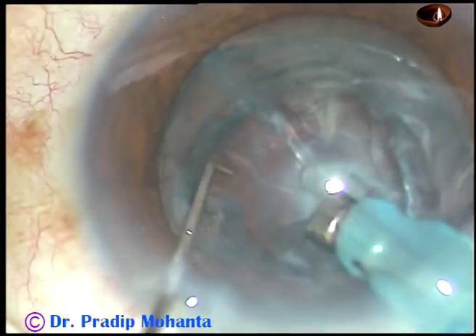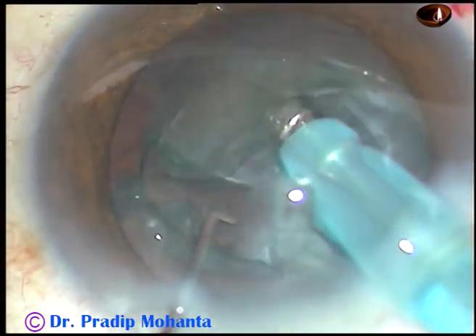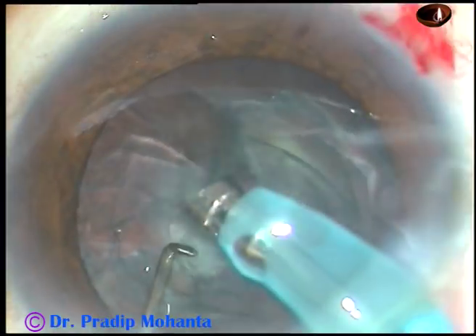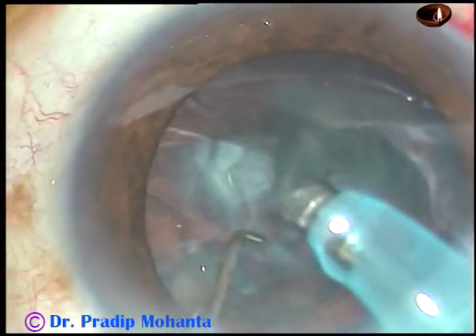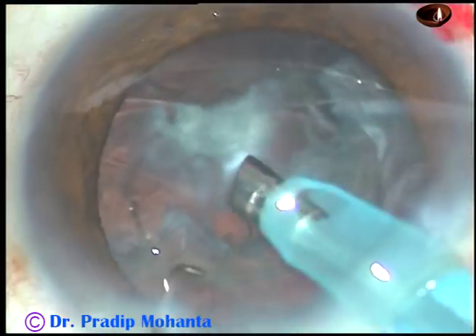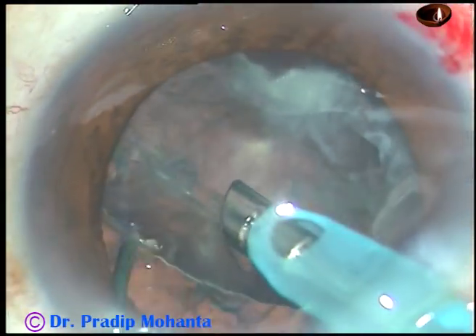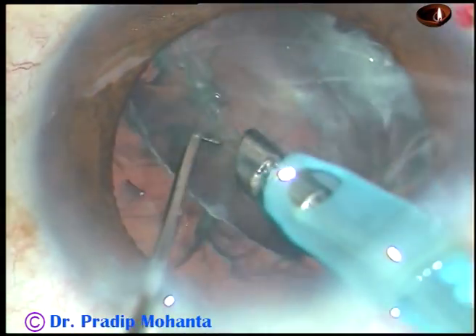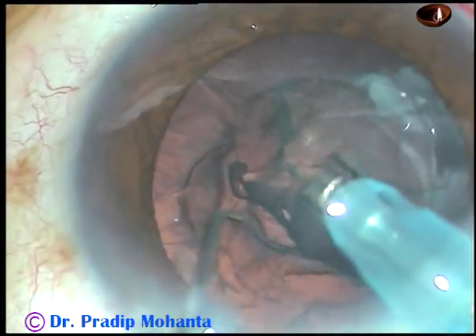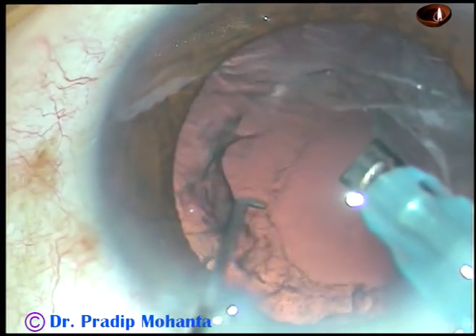The nucleus has been very nicely managed over the epinuclear shell. Even if a complication occurs now, no nuclear fragment will drop into the vitreous cavity. Now I am drawing the epinuclear shell very gently using very low vacuum towards the center, and I have been able to manage the epinucleus.